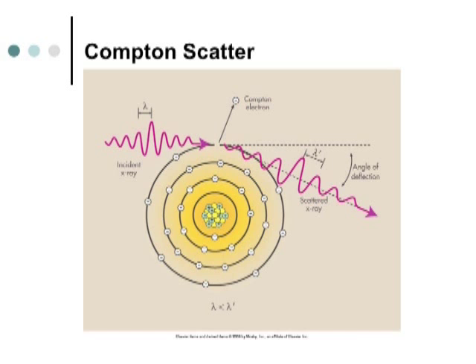Now the problem is, let's say I'm using 110 kVp. This is a photon that has a lot of energy. It hit an outer shell electron. It took a very small amount of energy to knock that electron out of its orbit. So the photon that's coming out of the patient still has what? Still has a lot of energy, right? It has enough energy to hit you and be absorbed by you now.